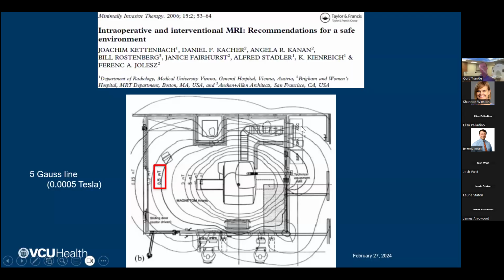Okay, that being said, there are some technical and logistical challenges that are unique to the MR environment, namely the massive strength of the magnetic field that's generated from the MR unit. Really, what's considered a safe distance from the bore of the magnet is this 0.5 millitesla or the 5 Gauss line. So there's sort of a decaying strength of the magnetic field as you go further and further from the bore of the magnet.